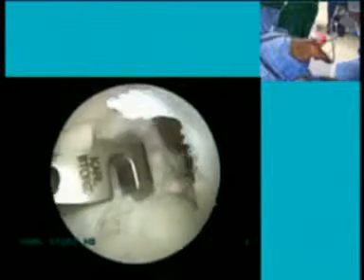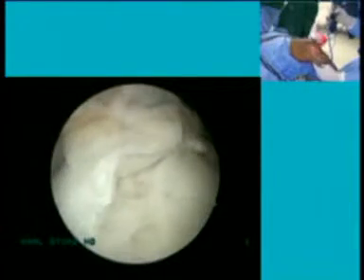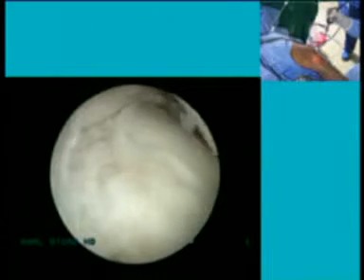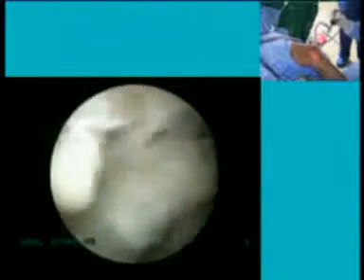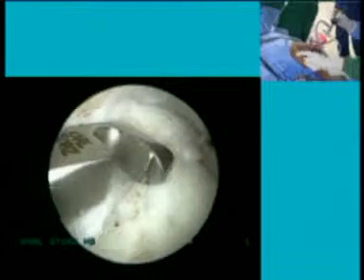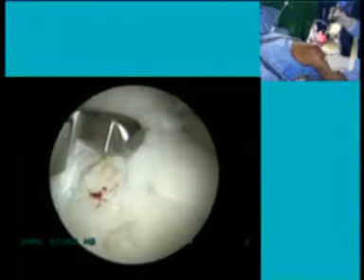This is a double bundle guide. It has two winglets, and we always start with the AM tunnel. The landmark for the AM tunnel, we can see it here. Therefore, it's nicer to leave the remnant intact. A very good landmark for the tibial ACL insertion, especially the AM insertion, is the anterior horn of the lateral meniscus. This guide has a little wing here, and if this wing is quite parallel to the posterior border of the lateral meniscus, then push this in again.